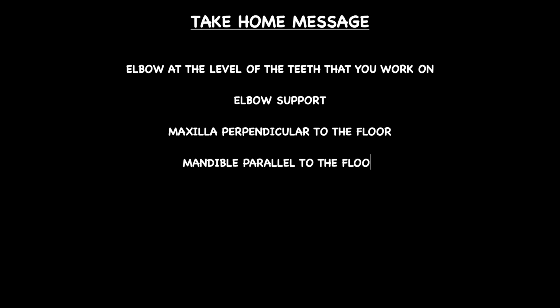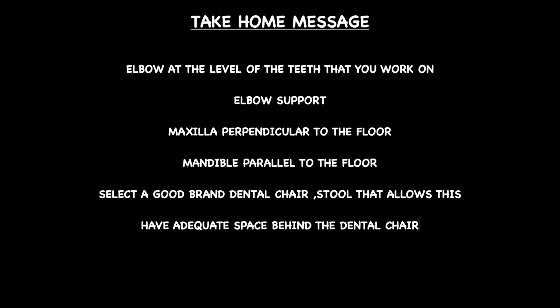So the take home message here is that number one, the tooth that you're working on should always be at your elbow level, and the elbow needs to be supported always. The maxilla has to be perpendicular and the patient has to be supine if you're working on a maxilla. When you're working on a mandible, the mandible needs to be parallel to the floor. And selecting a good brand of dental chair is important. The dental chair needs to go as low as possible so that you get an ideal chair positioning for the mandible, and the dental stool should also allow this.